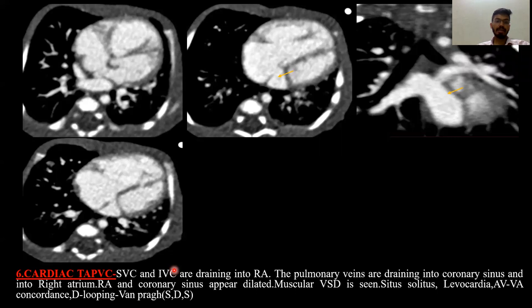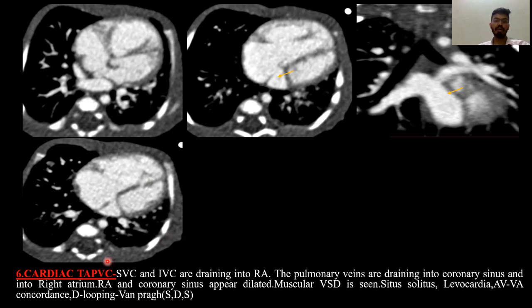The next case is cardiac TAPVC. The SVC and IVC are draining into the right atrium, and the pulmonary veins are seen draining into the coronary sinus and then into the right atrium. The coronary sinus and right atrium are dilated, and a small muscular type VSD is also present. By Van Praagh: situs solitus, levocardia, AV-VA concordance, and D-loop ventricular topology.